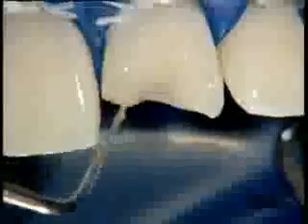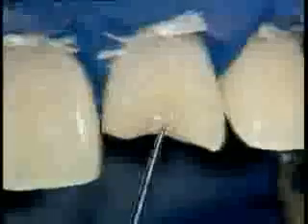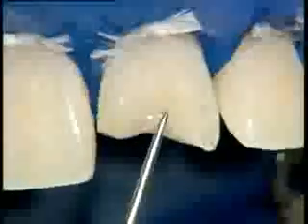The positioning of the flowable restorative is adjusted using a probe, and it is immediately light cured. A small amount of brownish dentine is still visible, encroaching onto the labial face, which is masked with the opaque shade of X-Flow. We now turn to the restoration of the lingual surface, which involves a layer of CeramX Duo D2 material, i.e. dentine shade.